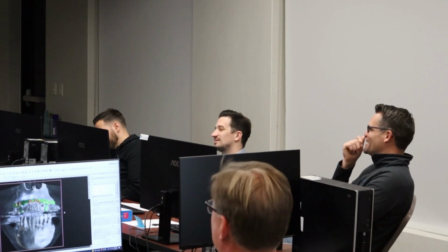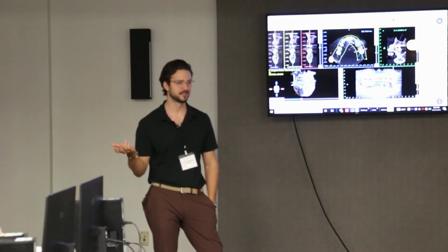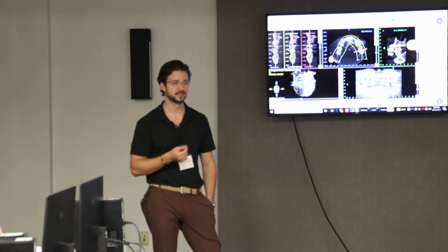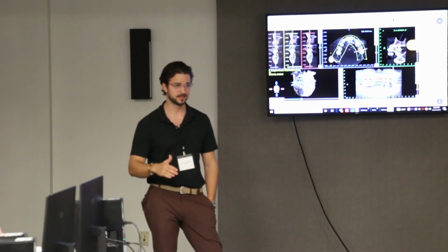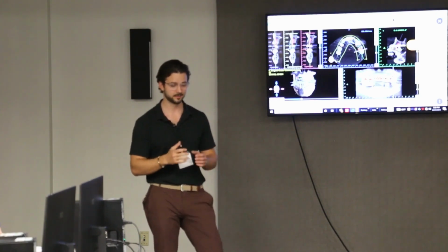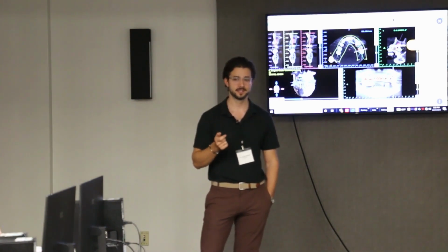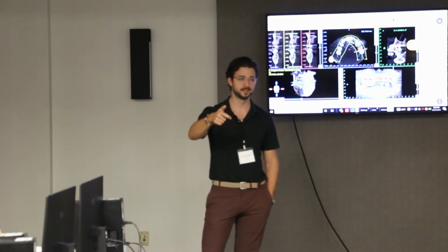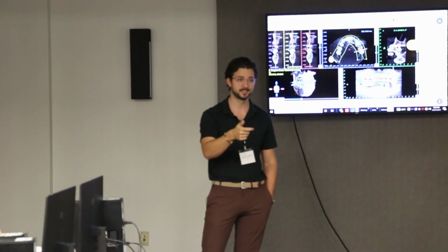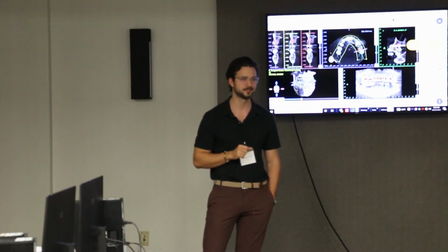Dang, that's not bad. Does anybody have any tricks or have they learned anything with that? I have a nice one that's a little bit simple, but it helps a lot when you're struggling to get the periosteum released. After you use your 15 or 12 or whatever blade you want, you have an incision fully crestal along the edge. You don't know if there are any tags of periosteum holding it up, because your blade has a diameter, and sometimes those invaginations are not cut by it. So a lot of the times I run an explorer in the first incision and basically have an intimate connection with bone all the way across. You will 100% feel tags of periosteum there. You just pull up on it and rip them off. It sounds so simple, but it helps with flaps a significant amount.